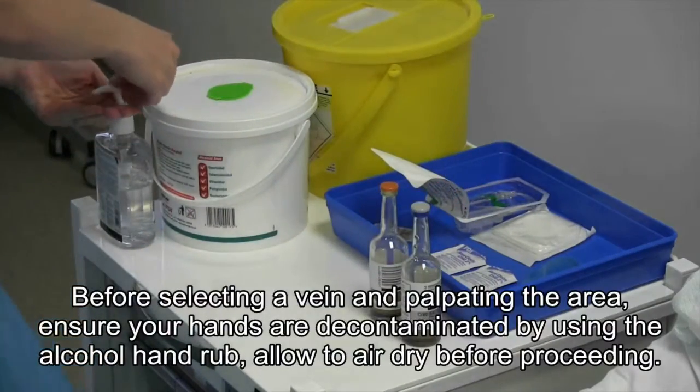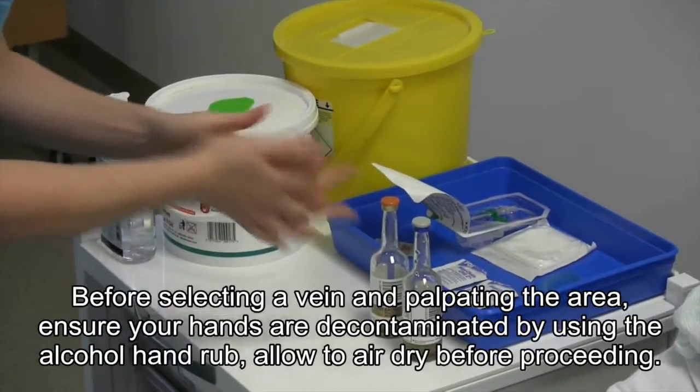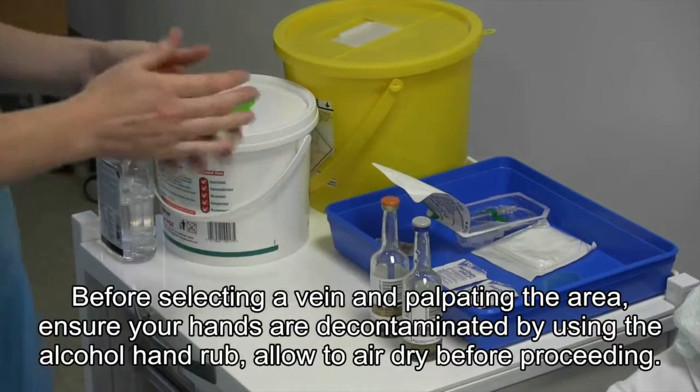Before selecting a vein and palpating the area, ensure your hands are decontaminated by using the alcohol hand rub, allowing to air dry before proceeding.